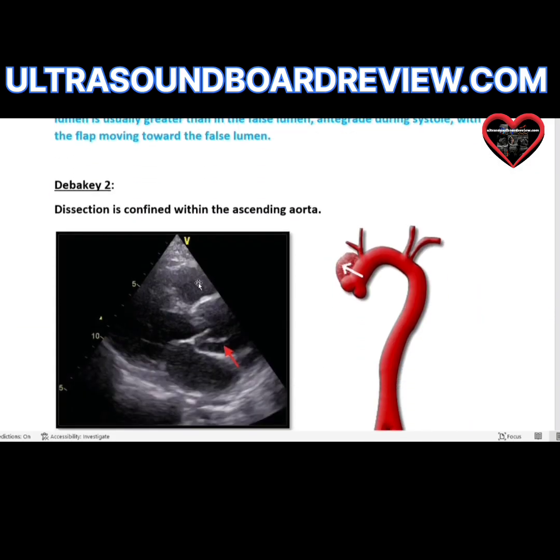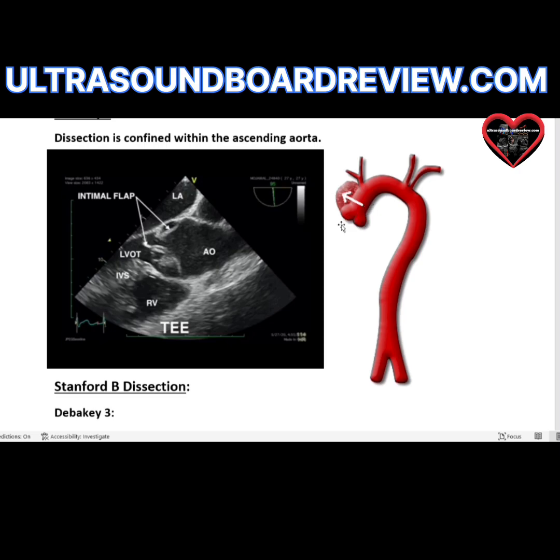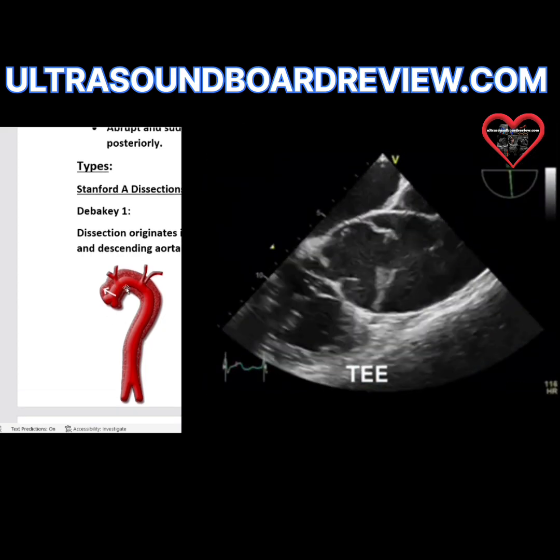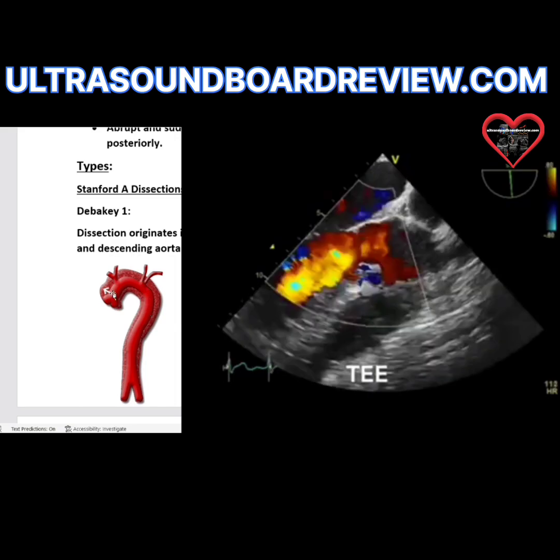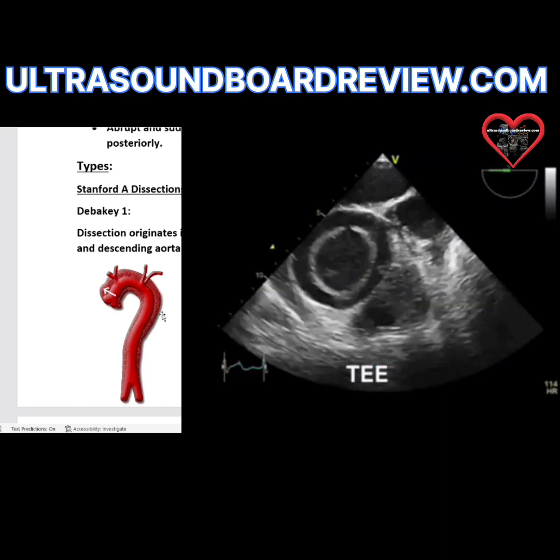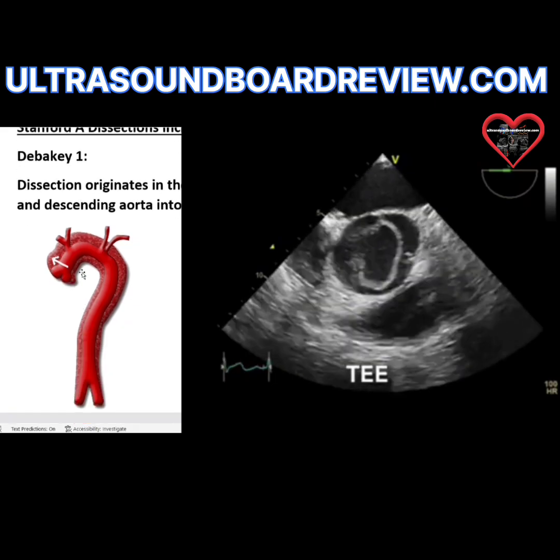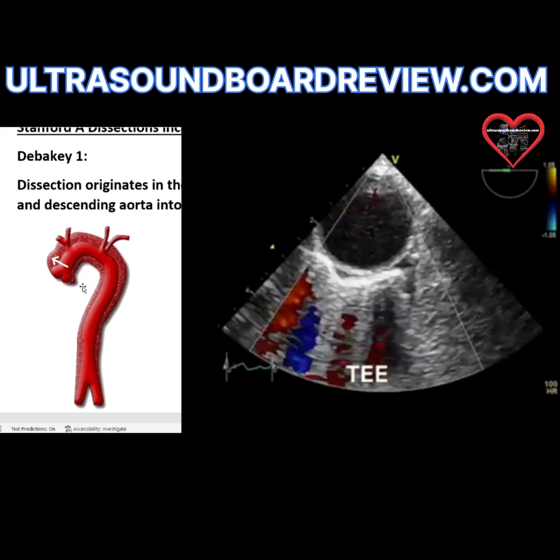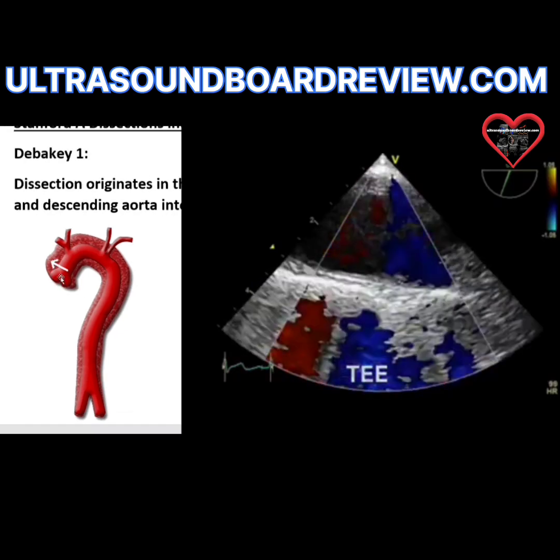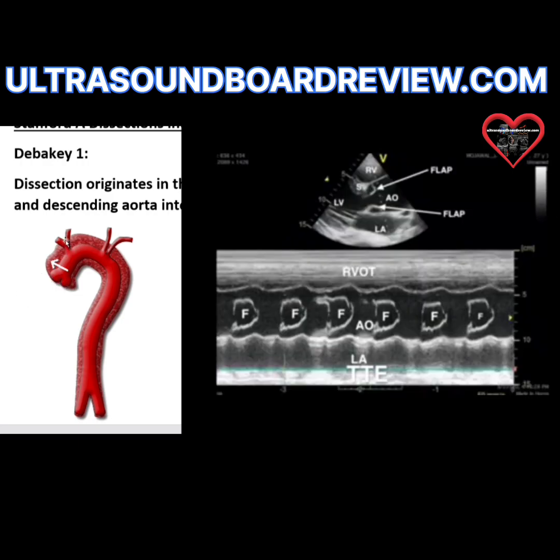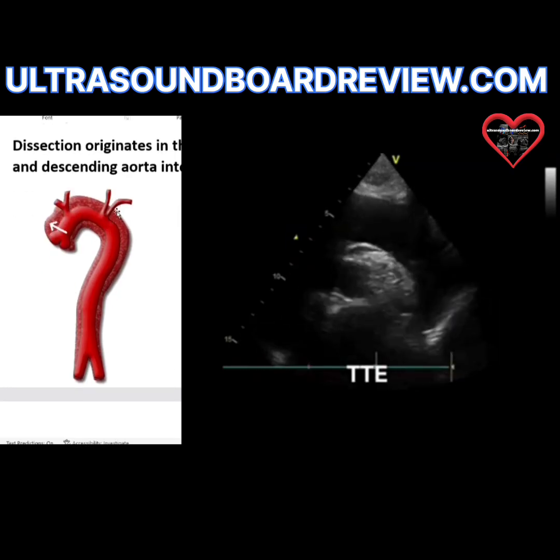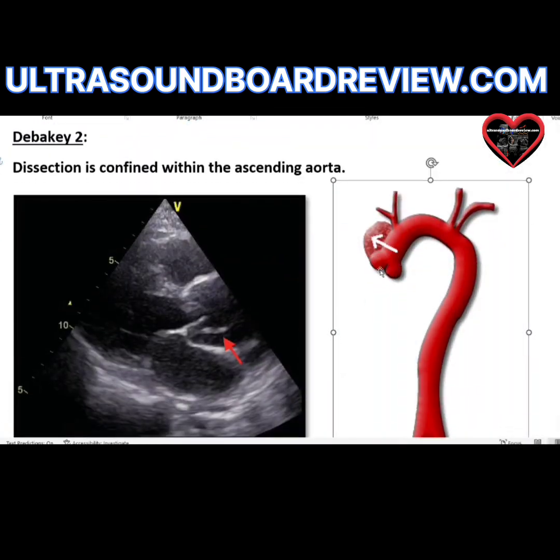DeBakey 2 only dissects the ascending aorta. DeBakey 1 and DeBakey 2 are the most dangerous because if the ascending aorta dissects, it will affect blood flow going to the coronary arteries, which branch there. You can see in this image it's dissecting the sinus of Valsalva and beyond. If the coronary arteries are compromised, that will inhibit blood from entering them to perfuse the myocardium. Stanford A is the most dangerous period because both DeBakey 1 and DeBakey 2 involve the ascending aorta.